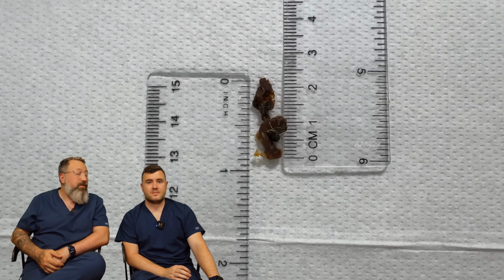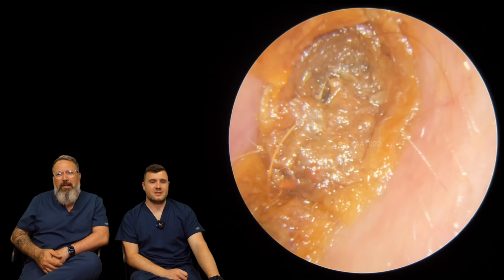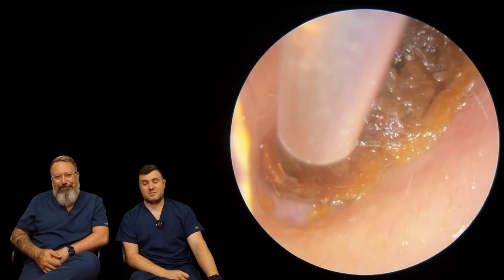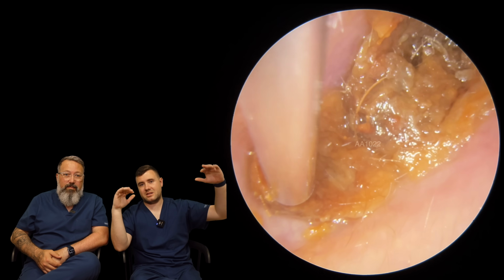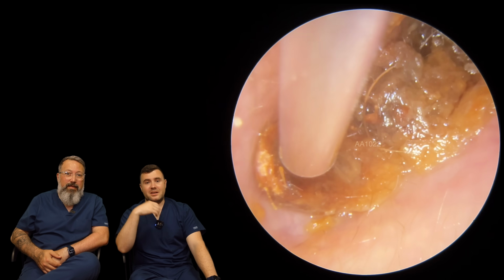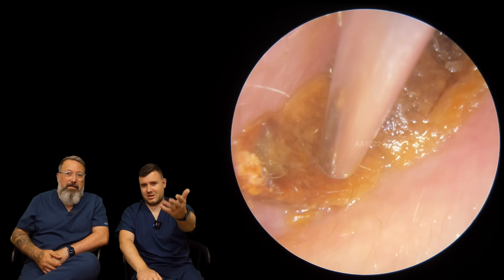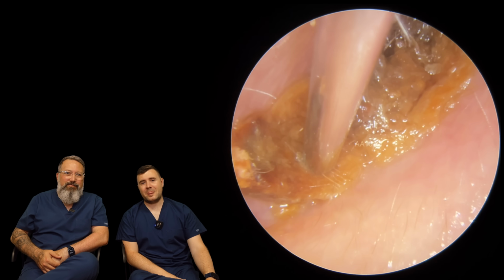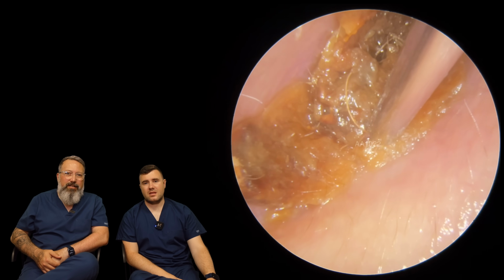So next patient's yours, which I think is skin and wax, isn't it? Oh, this is the compacted one. Oh yeah, look at that. Cotton bud user. You can tell straight away. You've got a big dent going straight down the middle of it. It's all squashed up against the ear canal. The patient admitted to it as well, coming in, to be fair. We do get a lot of people coming through saying, no, don't touch those things, and you take a look and it's like this, and you're like, yes. Really? It's really, really impacted, and you can see it's absolutely solid as a rock.